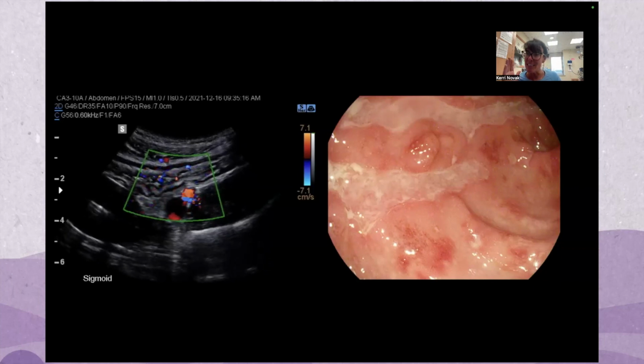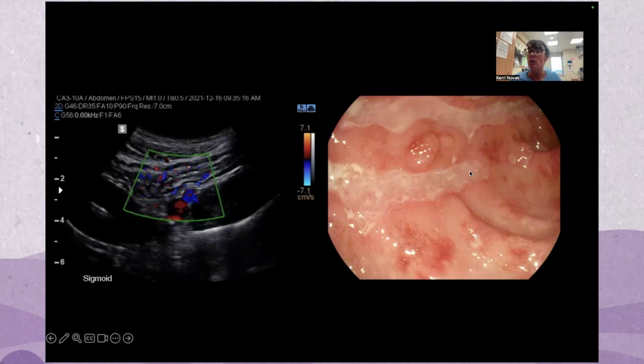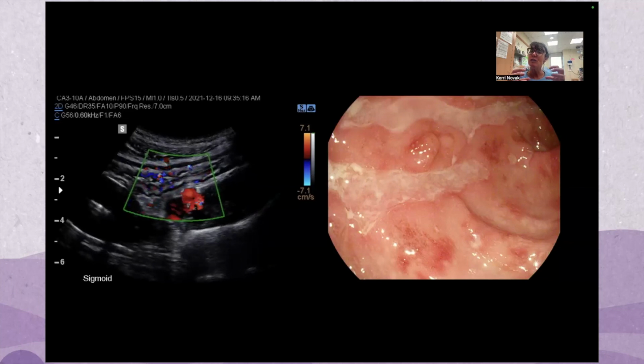Similar to that, a different vantage, so a different lens, is an endoscopic view. Here we have the sigmoid colon, and you've got large, deep serpiginous ulcers that reflect how the sigmoid colon looks on endoscopy. So where's the value here? You see both.